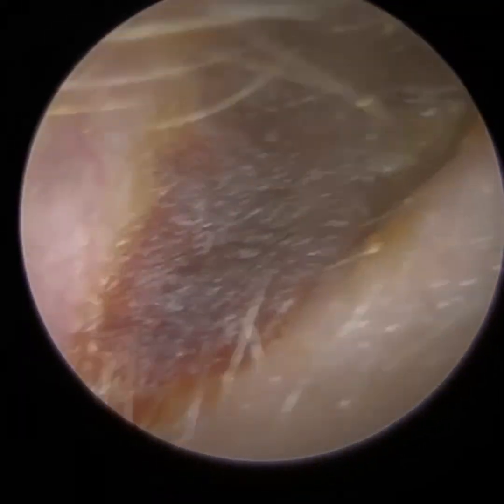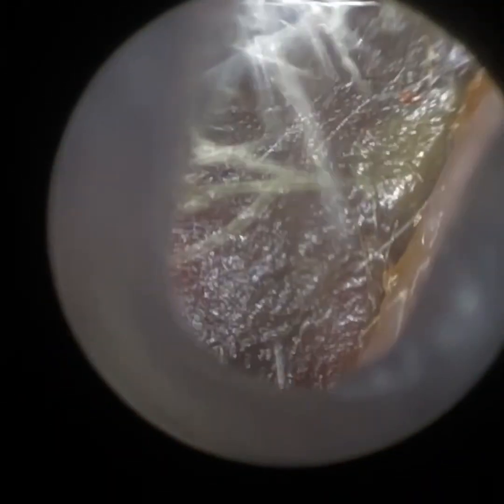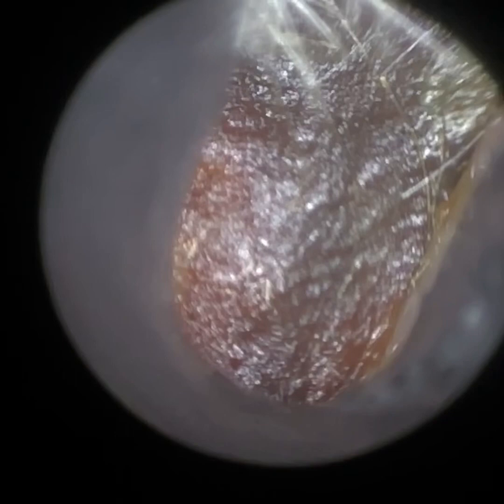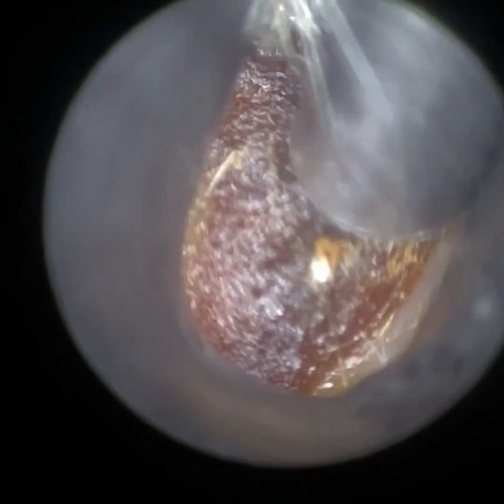Hi everyone, this is Mr. Neil Reiters here, consultant audiologist and director of ClearWax. Thank you for joining me in this quite complex case. So for a patient who attended with a blocked right ear and had been using cotton buds, the initial view that you saw was taken with the iClearScope, but I decided to perform the procedure with the Waxscope.